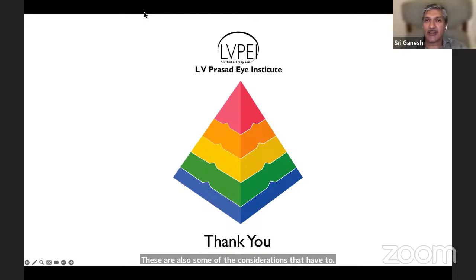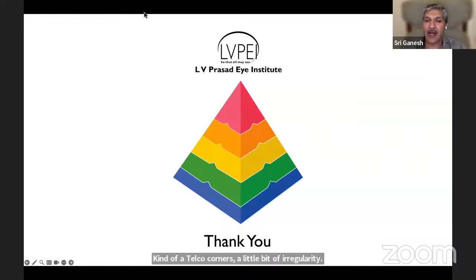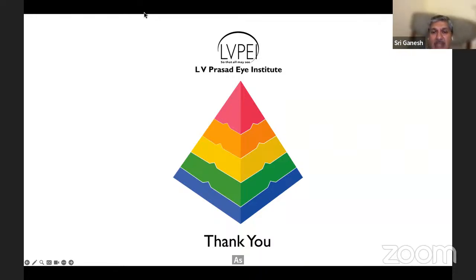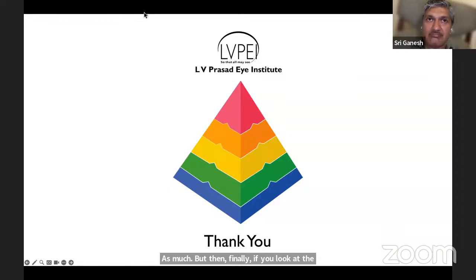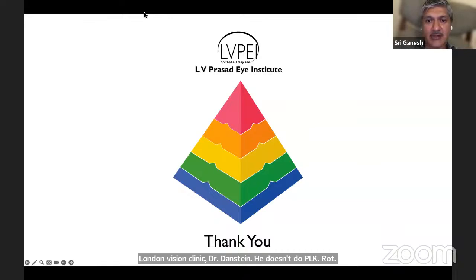Of course, surface ablations. In many places, surface ablations are becoming very popular because it's almost idiot proof in the sense that it's very easy to do. Even if it's an early keratoconus or a little bit of irregularity, you don't have to break your head as much. But finally, if you look at the patient satisfaction and outcomes, I think with PRK, the patient satisfaction is not as good as with LASIK or with SMILE. So many of the institutions, including ours, have specific indications for PRK. We don't do PRK routinely. Even London Vision Clinic, Dr. Dan Reinstein, doesn't do PRK routinely. But it has its indications, and when it's indicated, we do PRK.